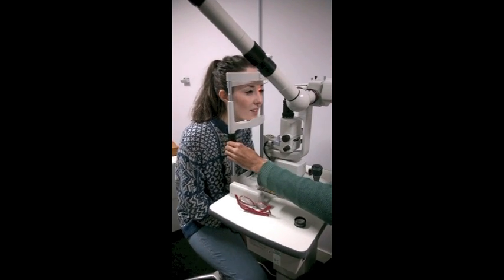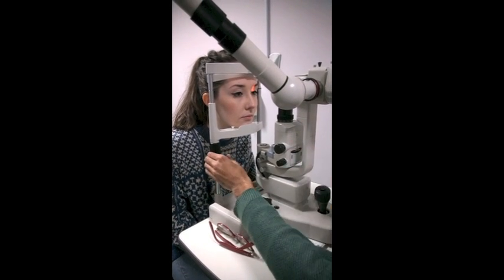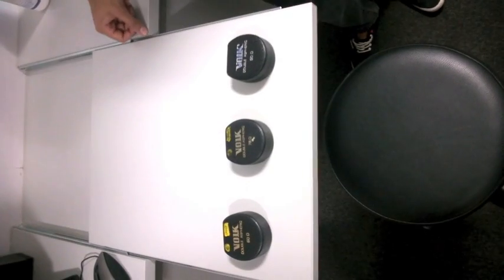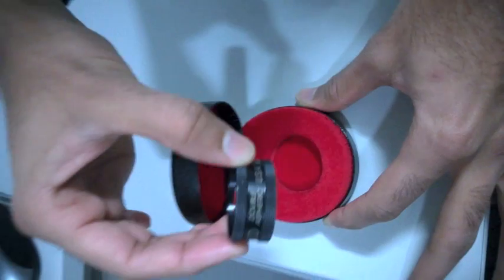Then set the patient up on the slit lamp. The patient's chin should be placed on the chin rest and their forehead should be placed firmly on the headrest. You should make sure that their canthus is in line with the marker and that they are comfortable before you begin. You must now select a Volk lens to use for this procedure.